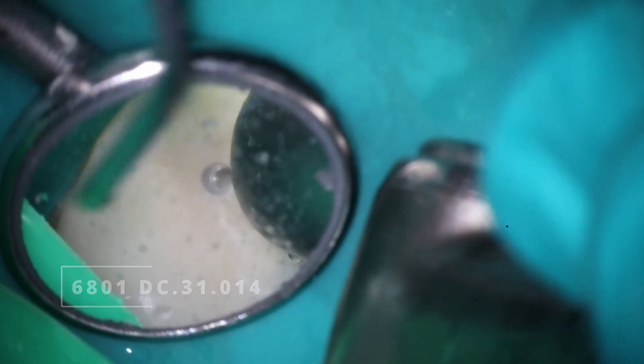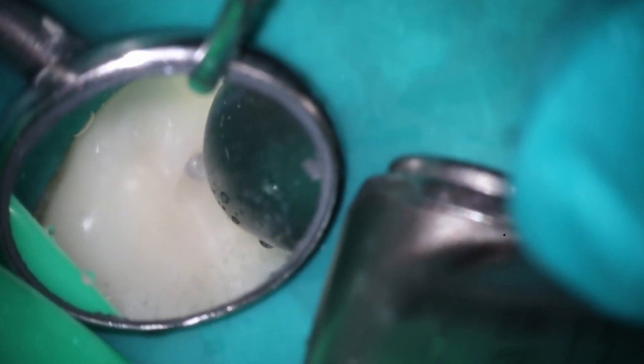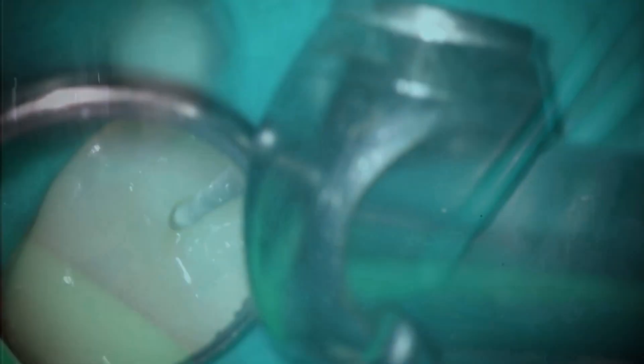Going through that zirconia crown using the same burs we would normally use. When it comes to the conversation around retreats — whether or not you want to use chloroform — the benefit is that chloroform does dissolve gutta percha, that's why we use it. But it also creates a huge mess. There are some hazards, and for me personally, it's just how sticky and messy it gets everywhere.